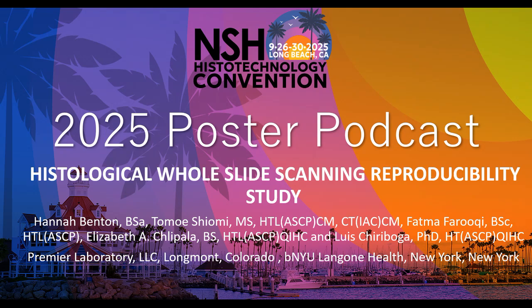The biopolymer should stain exactly the same way today, tomorrow, next week, unless something in your pre-analytical steps, your stainer, or your scanner changes. The goal is to be immediately able to see that change and react to it, normalize it, bring it back under control, and keep it all nice and uniform so that everything is the same when you're looking at it.